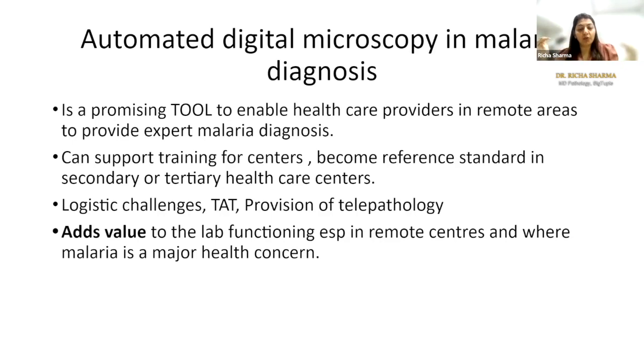So telepathology is going to bridge that gap. Also, it adds value to the overall lab functioning of that particular center that is present in remote centers or in areas where experts are not available. So, do we need to automate digital microscopy for malaria?